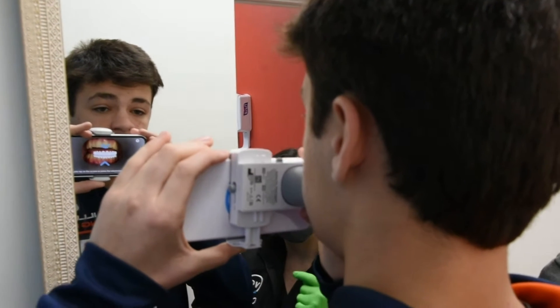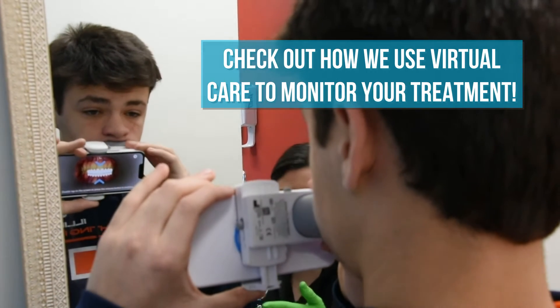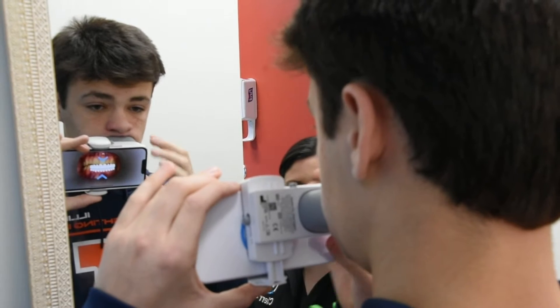Tap on the screen. For this step, bite down your back teeth and keep your teeth together. Tip your chin down. Double tap to continue. There you go. Double tap. Bite down.